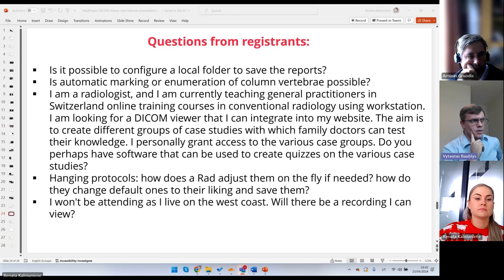We would be open to discussing the possibility of providing them our development kit, so we could check how to do it. But at this point, in our product it is only manual.